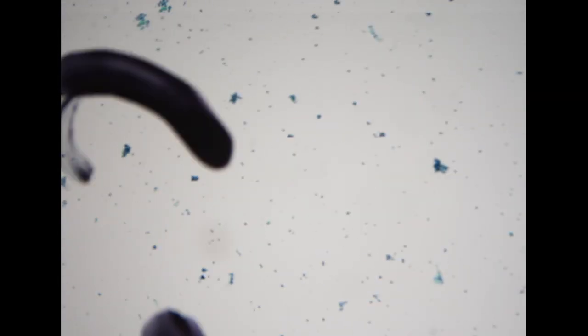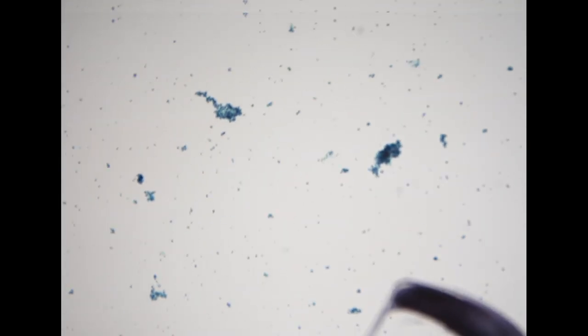Just on low power, we do see some cellular aggregates, as expected because this is a washing cytology specimen. But additionally, we also see a lot of single cells in the background. Most of the cells show a relatively immature, high N/C ratio appearance.